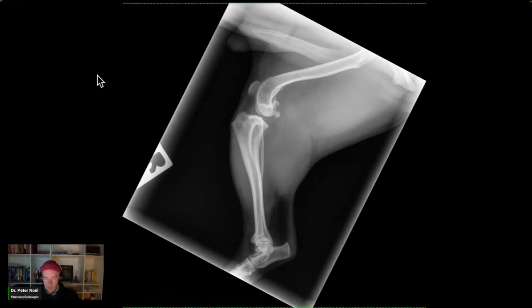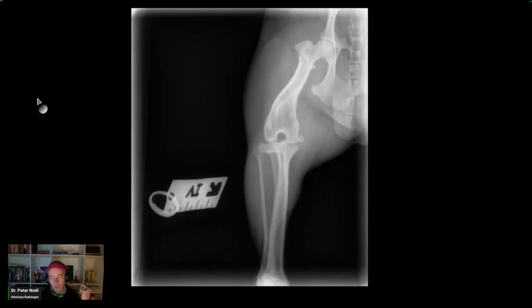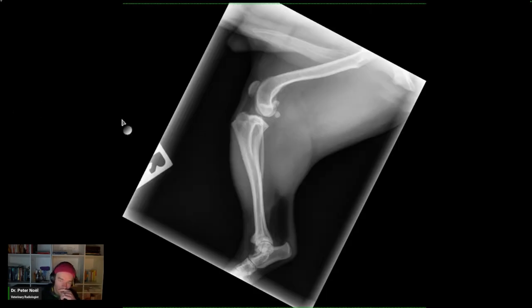So this dog is limping. He's a 4-year-old limping dog. Okay. What do you got? Anything normal? Limping? You have to be careful, right? I'm not going to try to dissuade you that this animal has pathology, but you have to be careful. Sometimes the study doesn't have the answer.